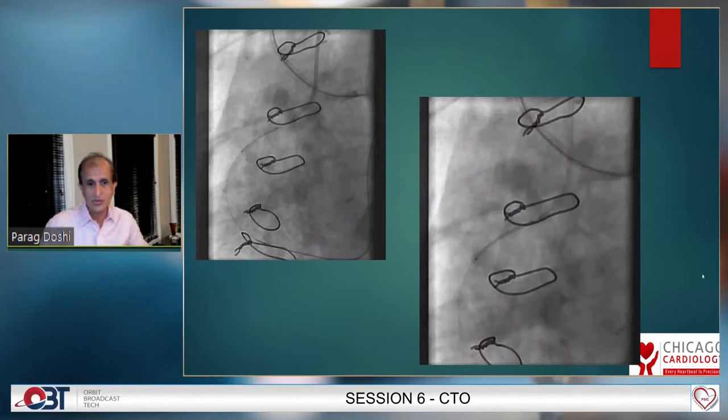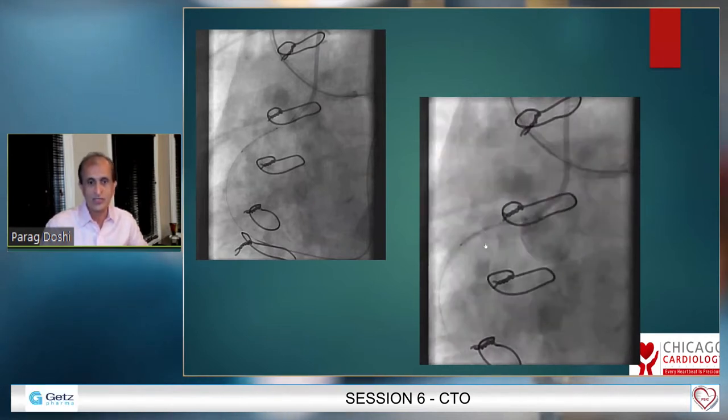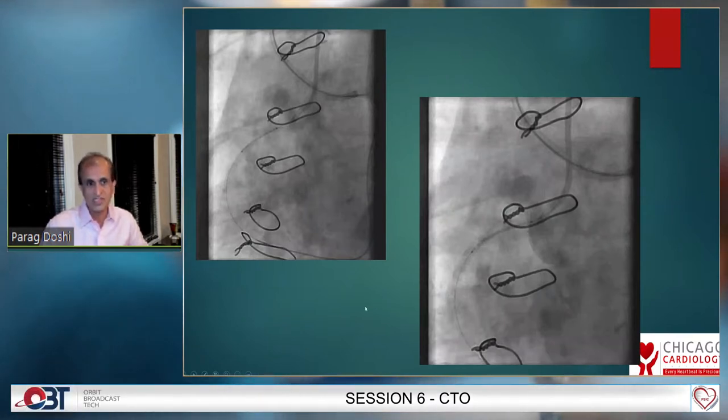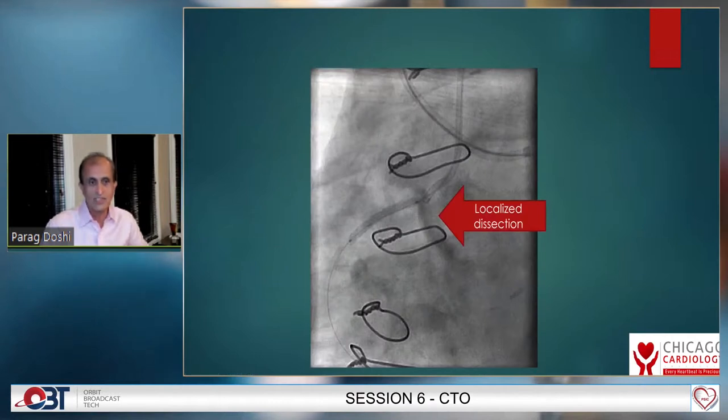Now when you do this second, very gentle injection, you can see that there's a slight dye staining. And this is the picture when I'm putting the stent across. And now you can see the localized dissection. These are my early days. I thought that I had done the stent and taken care of all of it, but if you look carefully, the stent has not covered the ostium. It is just kind of cut short, exactly at the ostium.